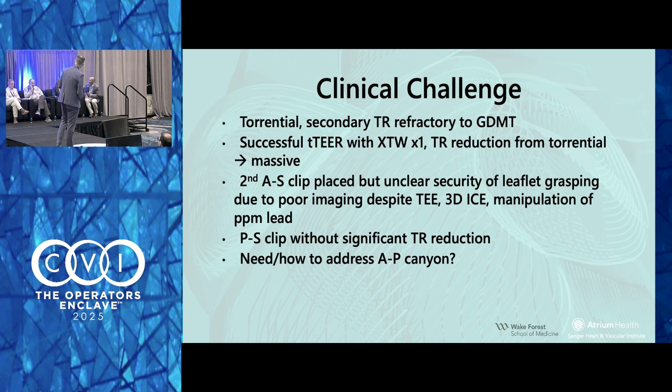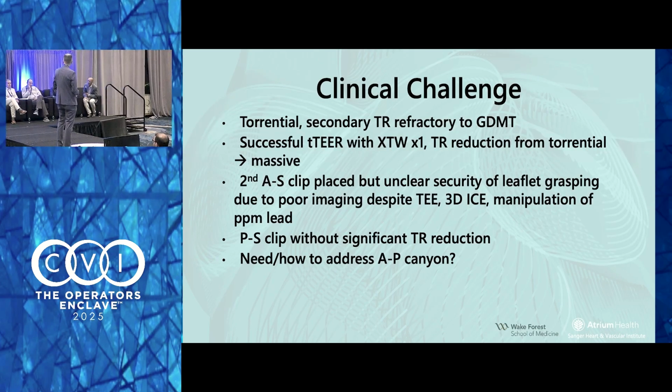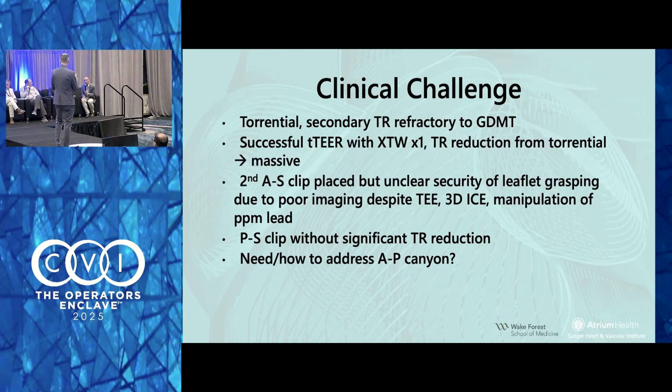Great case. So two devices, residual TR in between. How would you manage? There's only one that we left. So we only had one clip on. We took out the posteroseptal one because it didn't change anything.